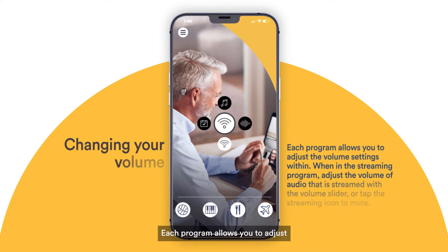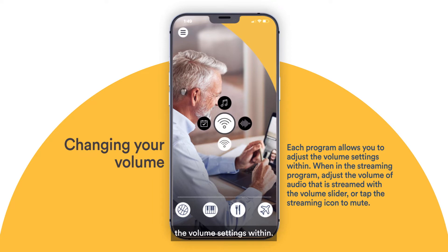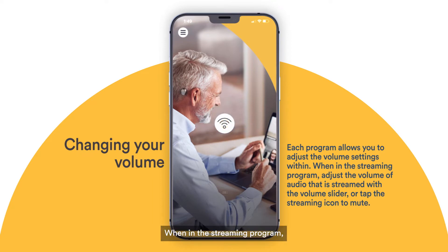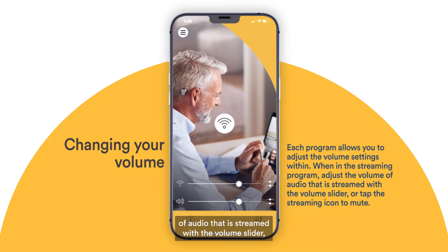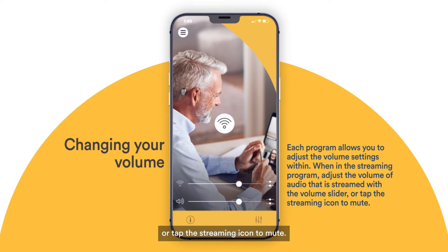Each program allows you to adjust the volume settings within. When in the Streaming program, adjust the volume of audio that is streamed with the volume slider, or tap the Streaming icon to mute.